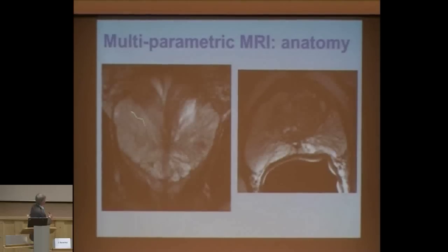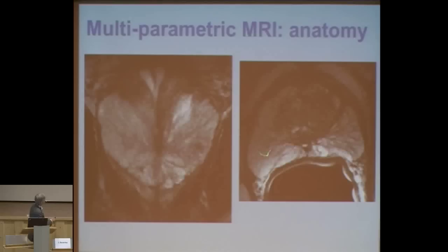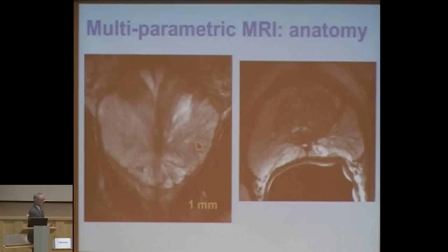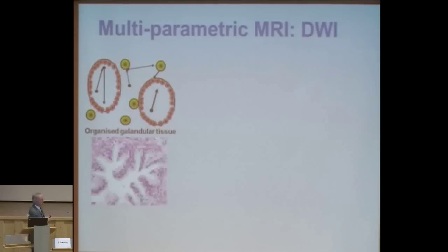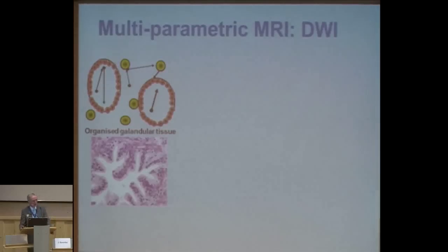Here you see the prostate on the coronal view, axial view with benign prostatic hyperplasia, and if you carefully look you can see a very small tumor — high-resolution images. However, those dark spots can also be something else like fibrosis or prostatitis. So we have more techniques.